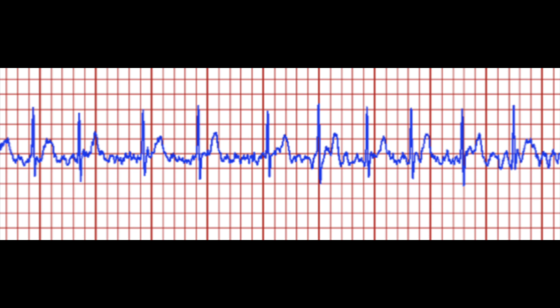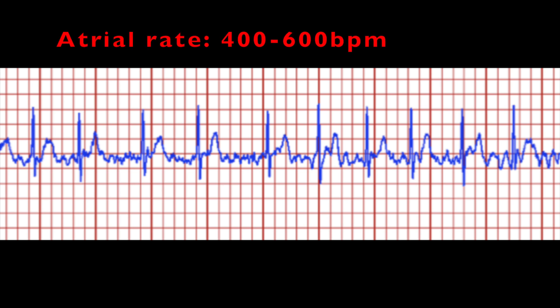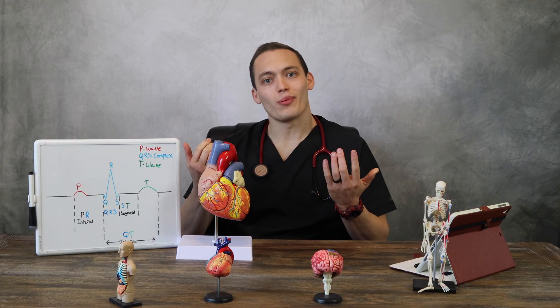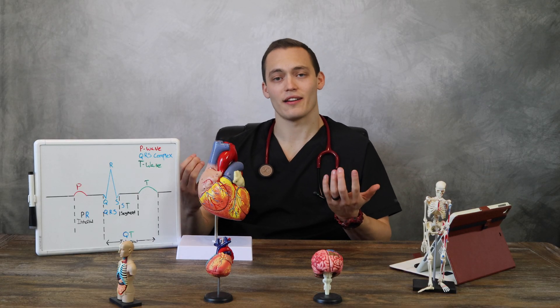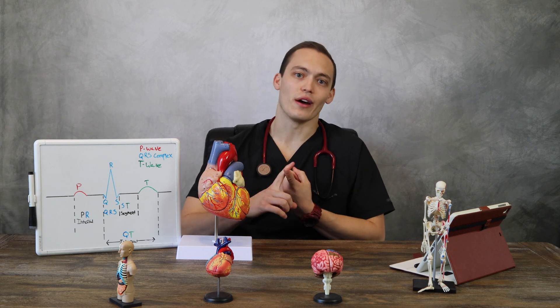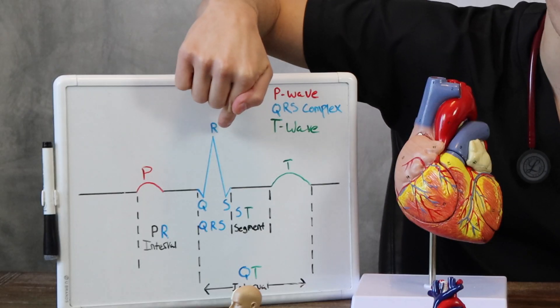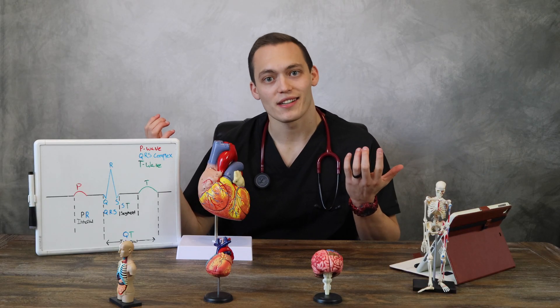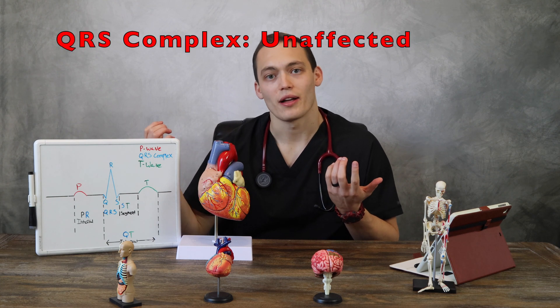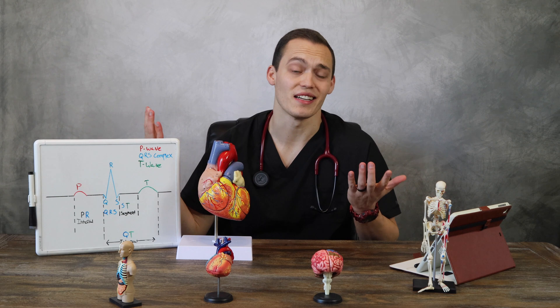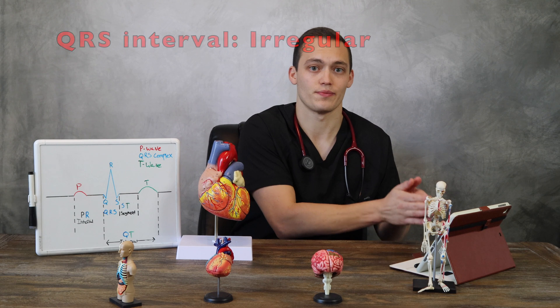During AFib, the atrial rate can be anywhere from 400 to 600 beats per minute. Regarding the QRS complex — it really doesn't get affected. The QRS complex shape will be normal and short in duration as it normally is. The only difference is that the QRS complexes will not occur at regular intervals.